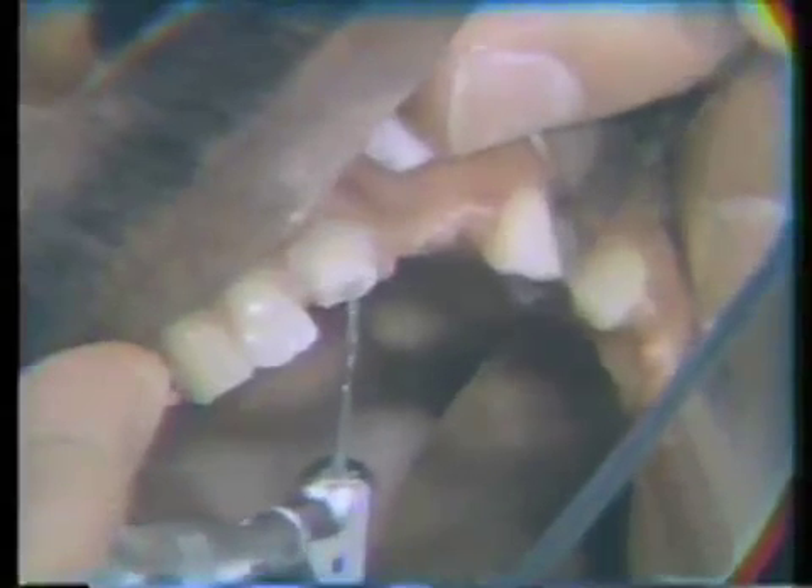You'll note that we have not reduced the tooth completely. When you have a fairly sound tooth, you reduce the length of the tooth until you have fairly solid dentin around the orifice of the root canal.